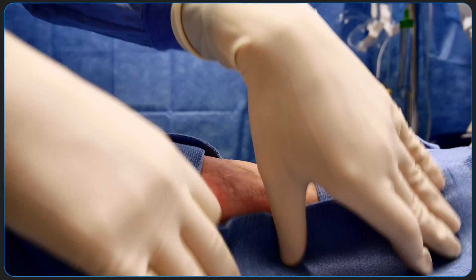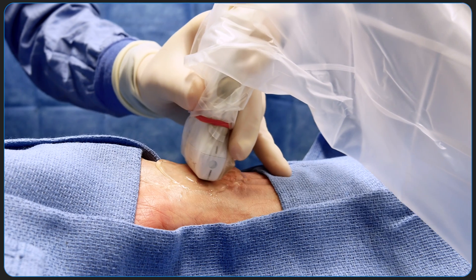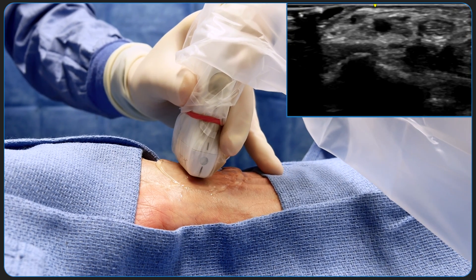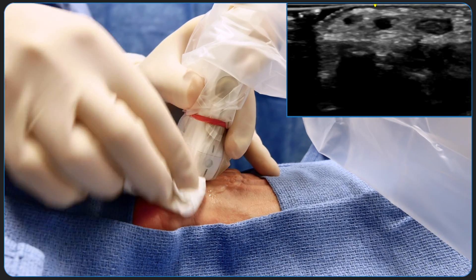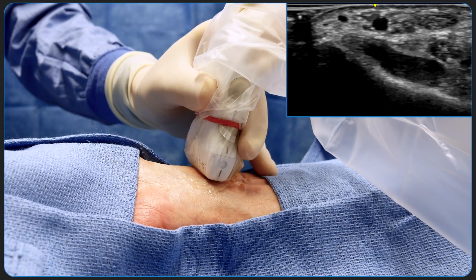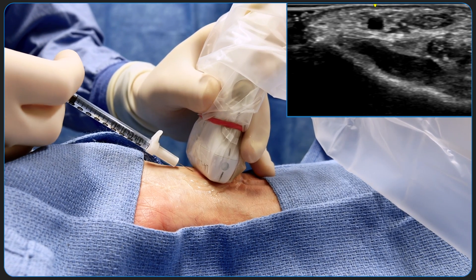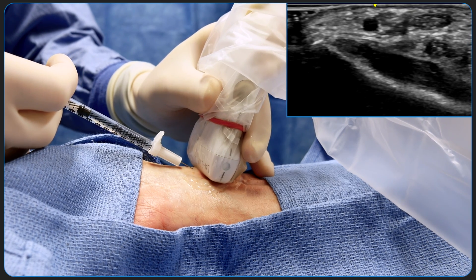The patient is first prepped and draped for sterility. The vessel is identified and the approximate center of the probe is aligned with the center of the vessel. Local anesthetic, in this case 1% lidocaine, is administered subcutaneously for patient comfort. The injectate can be visualized on ultrasound.